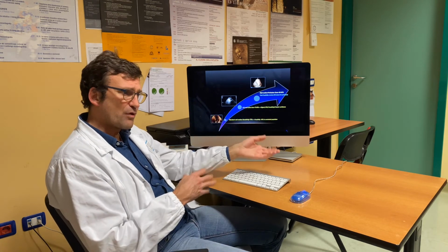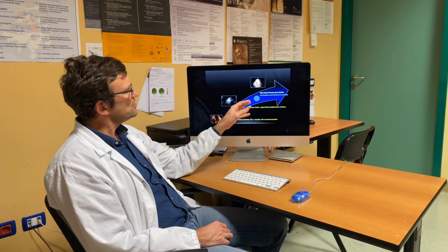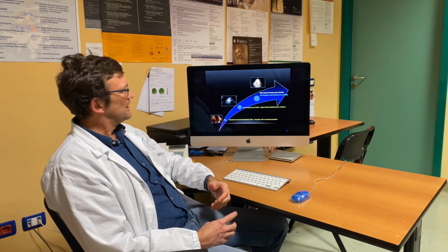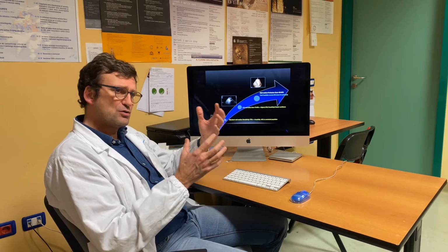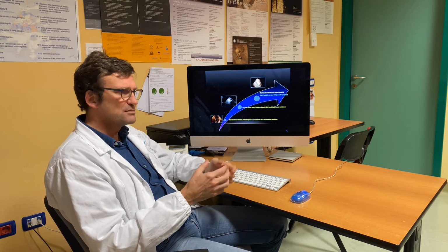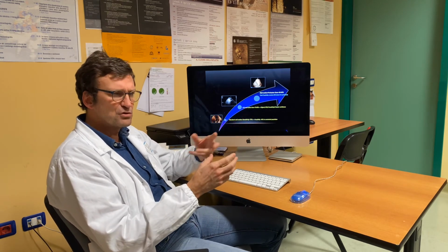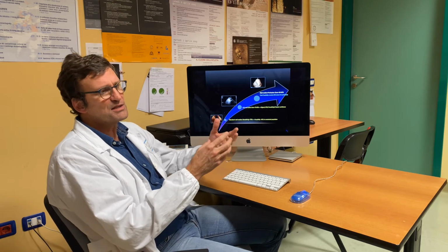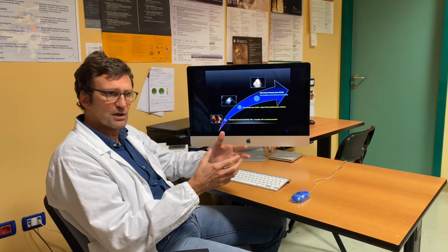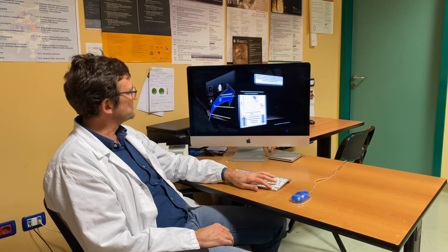So you can do this at rest and stress and be quite confident about wall motion assessment. When you use perfusion, your sensitivity goes sky high, and maybe even too much, because you lose a little bit in specificity, because you're getting trapped in your diagnosis, everything. So microcirculation, you can see perfusion defects and cardiomyopathies. So it's not very specific for a severe stenosis, but it helps a lot in cardiology in general. So, yes, and this is CFR.